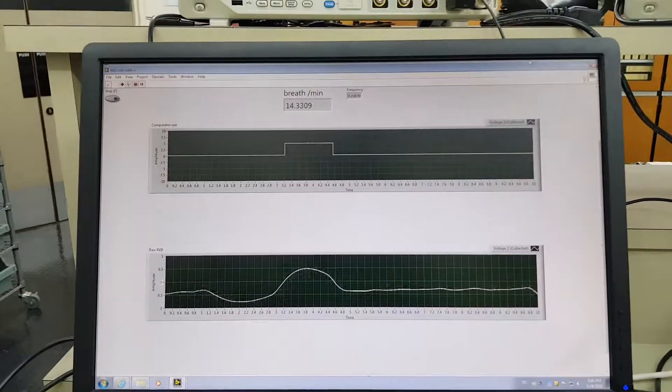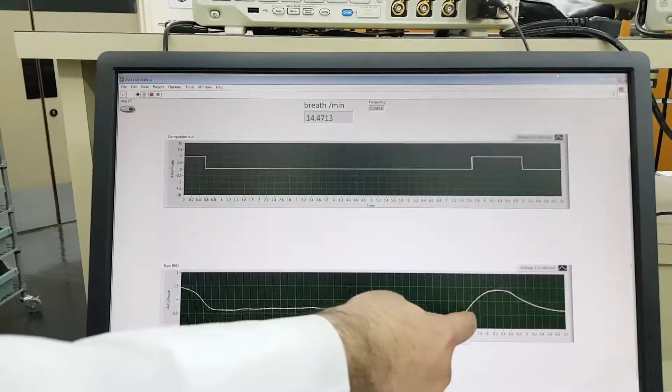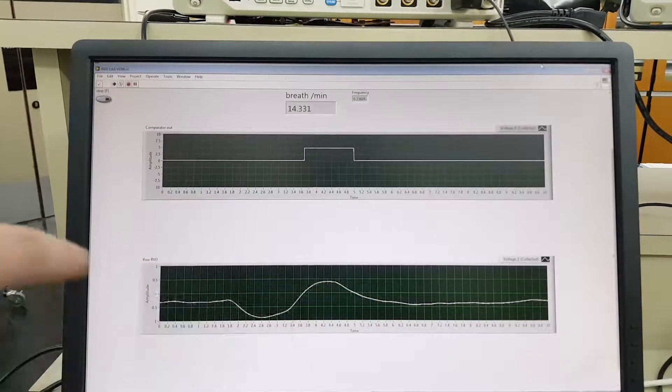We can see the inhale and exhale pulses. When it becomes cold it goes up, and when it becomes high heat it goes down.